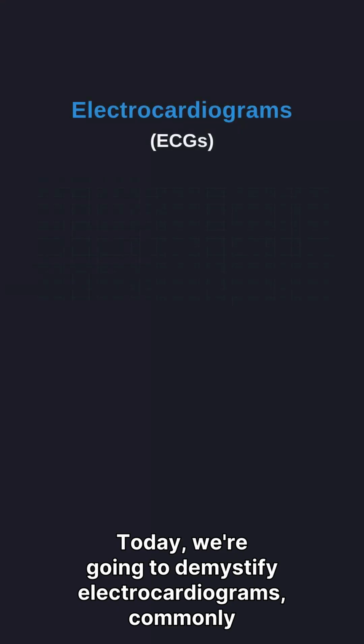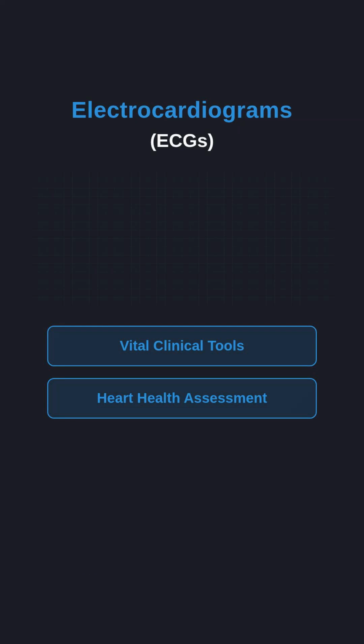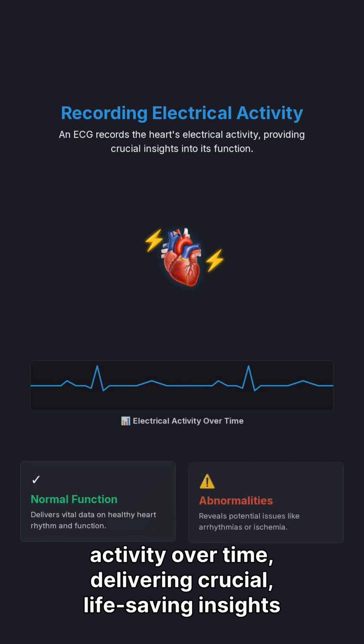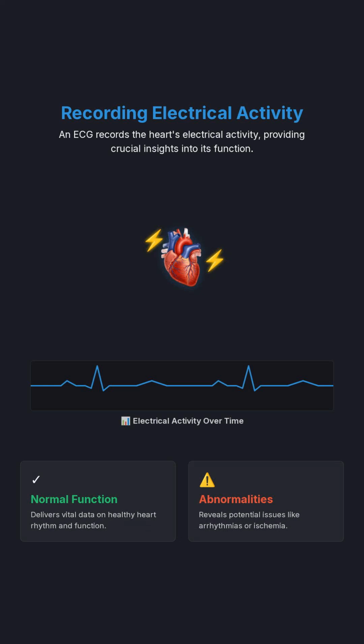Today, we're going to demystify electrocardiograms, commonly known as ECGs, which serve as vital, indispensable tools in everyday clinical practice for assessing heart health. An ECG precisely records the heart's electrical activity over time, delivering crucial, life-saving insights into its normal function, as well as any potential abnormalities that could indicate serious conditions.